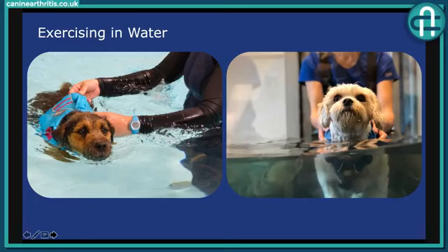I'm glad you said that, though, because as a vet, people often ask, because they know about hydro and the underwater treadmill, and they feel like it's the same thing. They say, oh, this centre only has the treadmill, so that's what we do there. But actually, it's really important that you are doing the right thing for what you're hoping to achieve in your dog. Absolutely. And we only have the underwater treadmill at Davies.